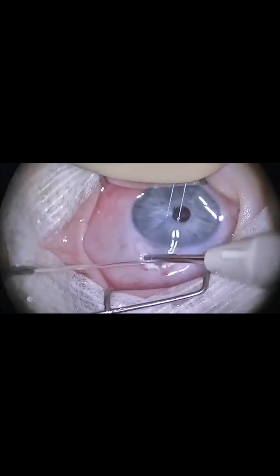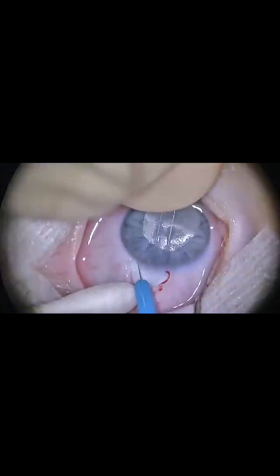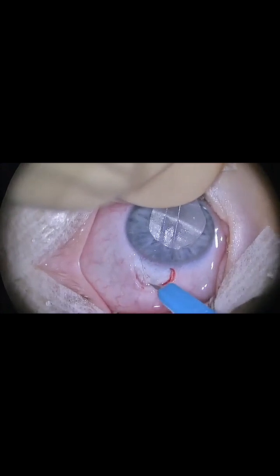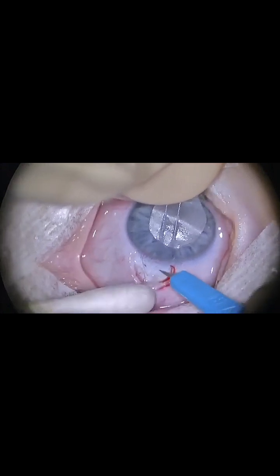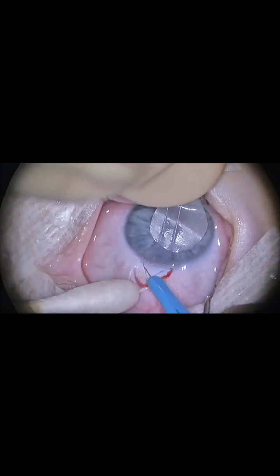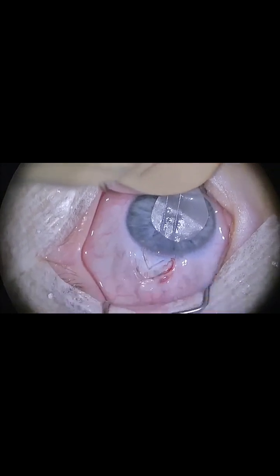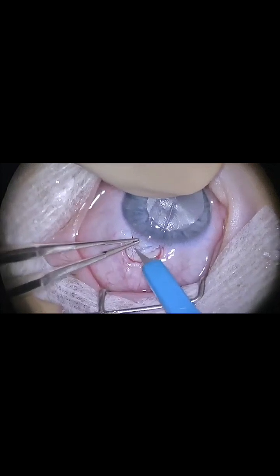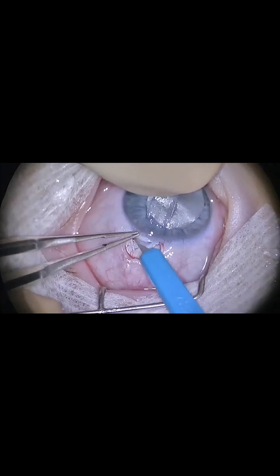This is a surgical video demonstrating an ab-externo trabeculotomy. A focal superior peritomy has already been performed, and we applied cautery for hemostasis. Here we are creating a partial thickness triangular flap with a super sharp blade. We will lift the apex of the triangle and score along the bed of the flap to achieve the desired thickness.